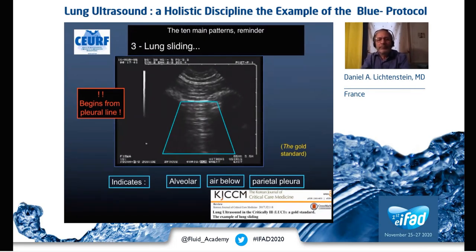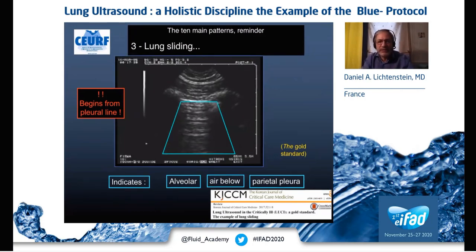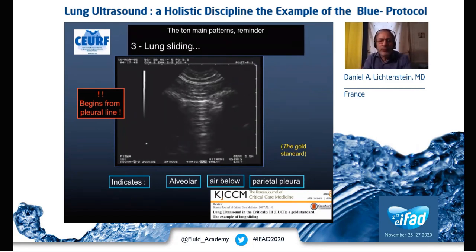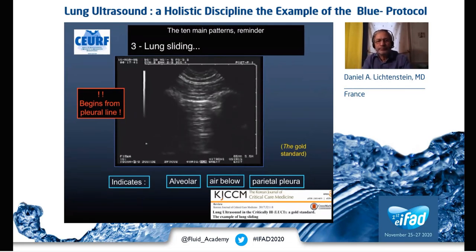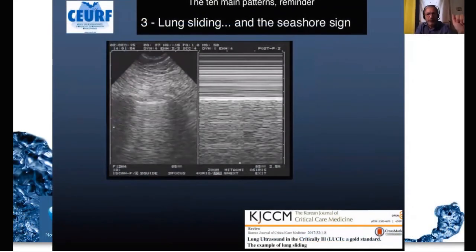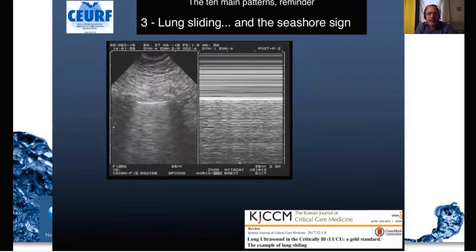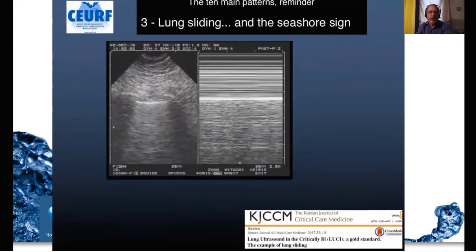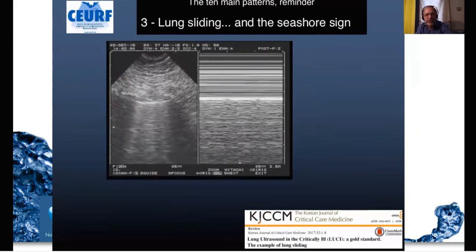If the image inside the quadrangle — which we call the Merlin space — moves, it means that we have lung sliding. The third sign indicates that we have the visceral pleura together with the parietal pleura; this moves exactly from the pleural line, not one millimeter above. We can combine those two images into the seashore sign, which is a way to see lung sliding in a frozen image.